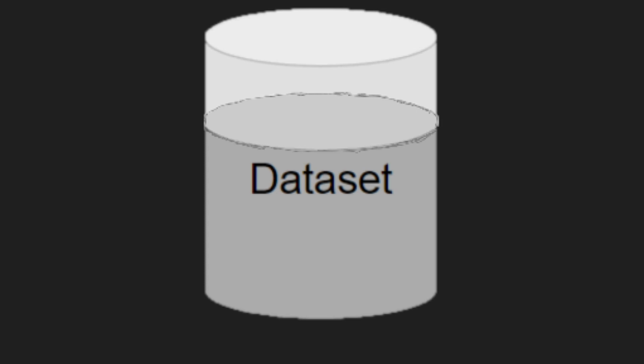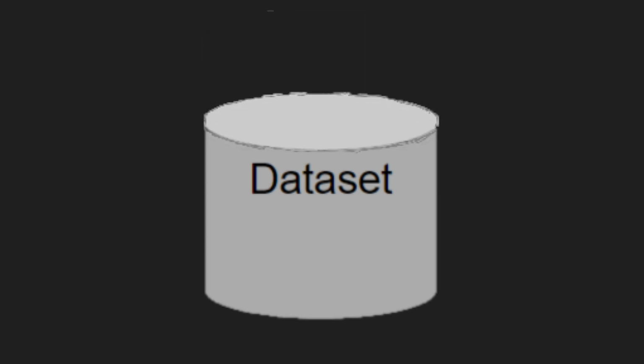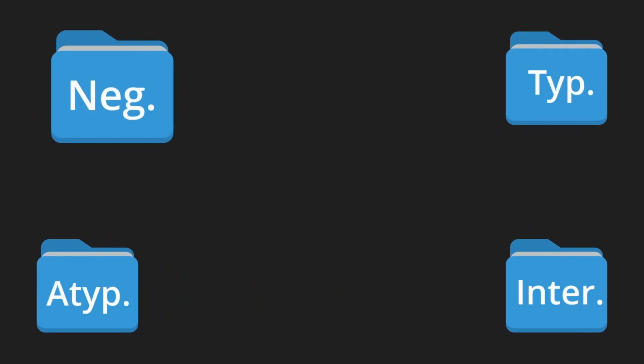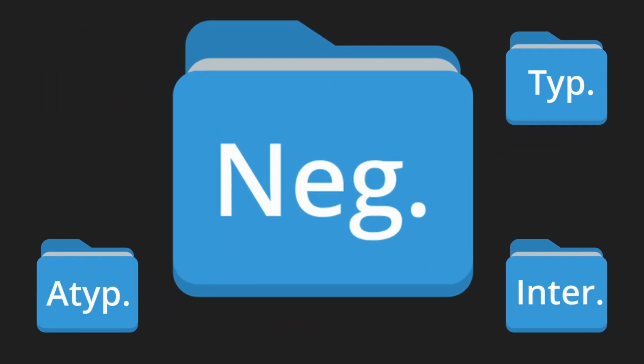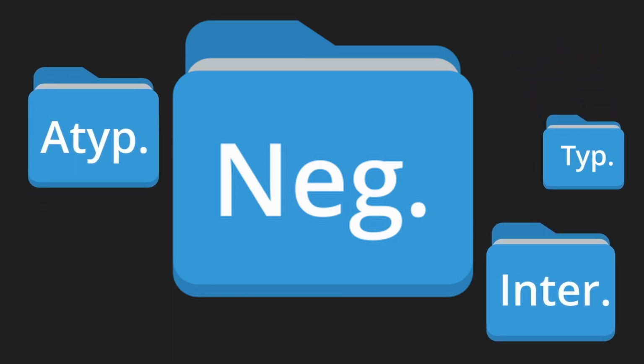Now we only care about the amount of images for the training set. I'll explain why we don't care about it for the testing set. Since we are training on the train set, we need to normalize the amount of files to keep bias at a minimum. Why would bias be affected? If we had 600 negative for pneumonia x-rays and roughly 40 to 50 x-rays for the other categories, like Joseph said before, our model will predict everything to be negative even without the patient bias Joseph fixed.